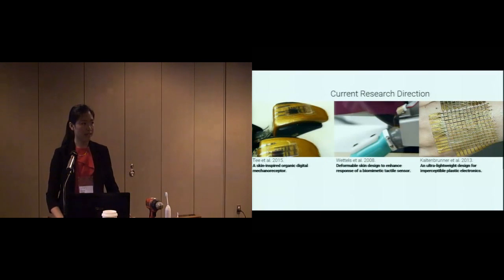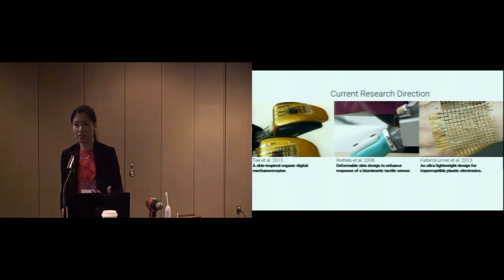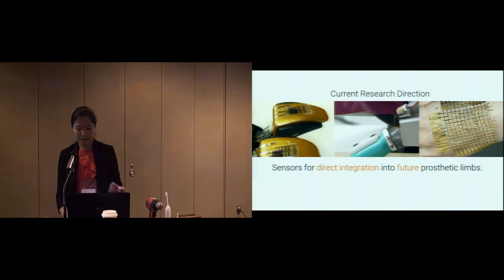So what are researchers doing about this? Well, actually, there has been a movement towards creating electronic skin. And just last year, there was some very exciting work released by researchers at Stanford University, and they created a thin film circuit that can convert pressure information into electrical impulses that could theoretically be interpreted by the brain. However, the challenge with such an approach is that it will likely take some time to come to market, and it would also likely be expensive. And this can be troublesome for those who rely on prostheses today.